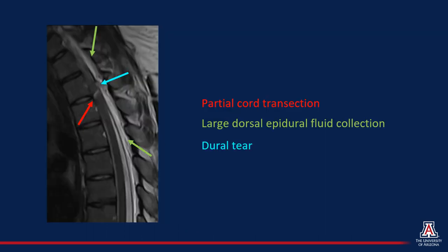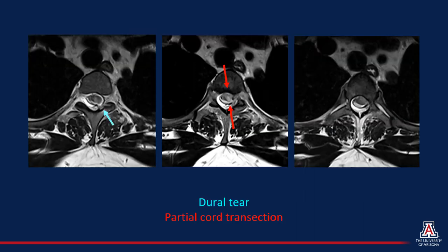These findings are also demonstrated on the T2-weighted images. Again, here we have a partial cord transection visualized with the red arrow, a large dorsal epidural fluid collection with the green arrow, and here we can see a dural tear with the blue arrow. The T2-axial images again show the blue arrow pointing out the dural tear and red arrows pointing out a left hemicord transection.